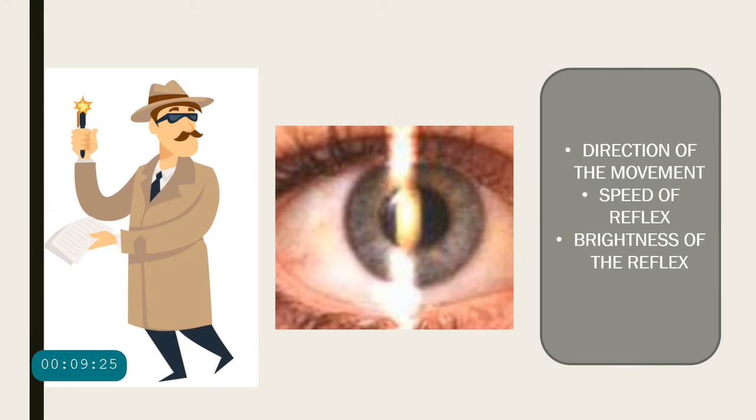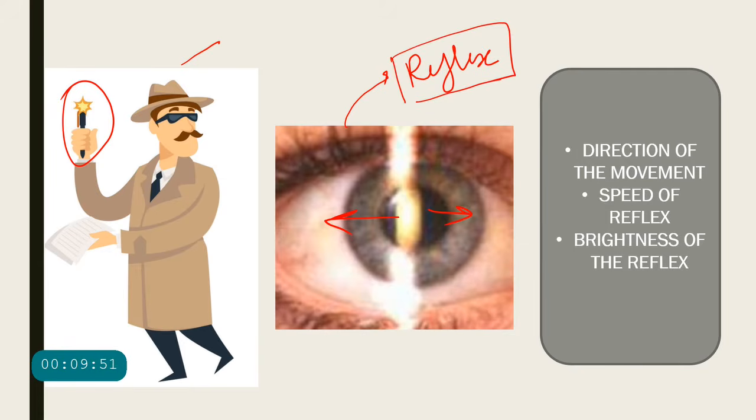So basically, we are acting as detectives in retinoscopy. We are carrying our retinoscope. With that retinoscope, we are trying to put a slit across. In streak retinoscopy, of course, we are trying to put a light into the patient's eye, and then we are moving it across the eye. The eye, in response to our light, is behaving and giving a reflex to us at the far point of the eye, and then we are studying the nature of that reflex.